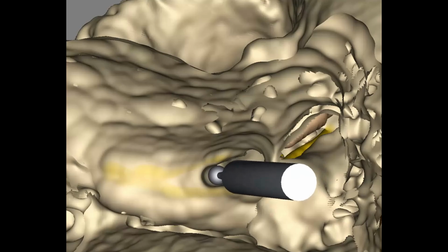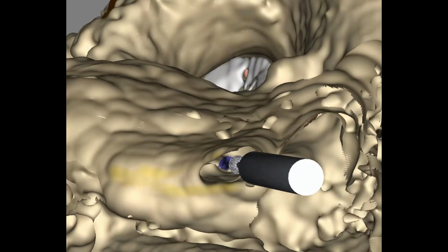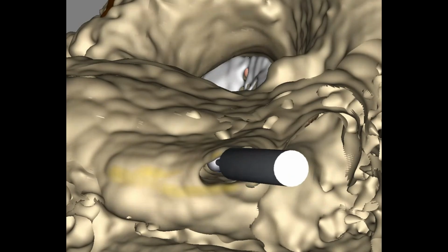If the bone is well pneumatized, it can be relatively easy to complete, although following air cells and solely relying on them to show you the way can never replace a solid appreciation of the anatomy if one wants to avoid complications.